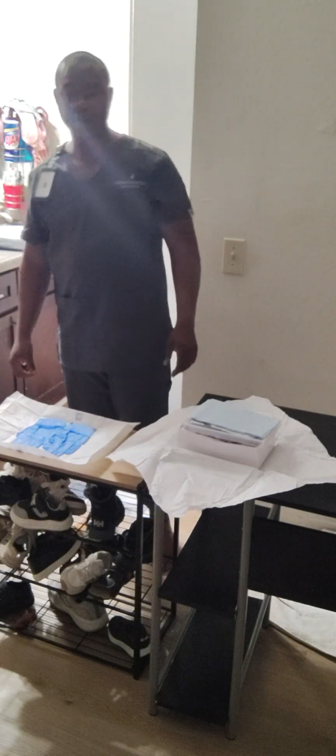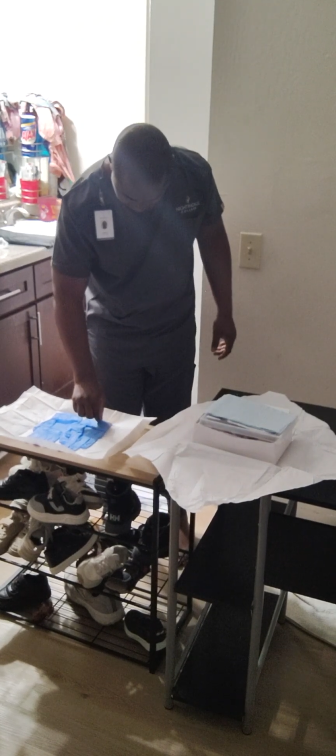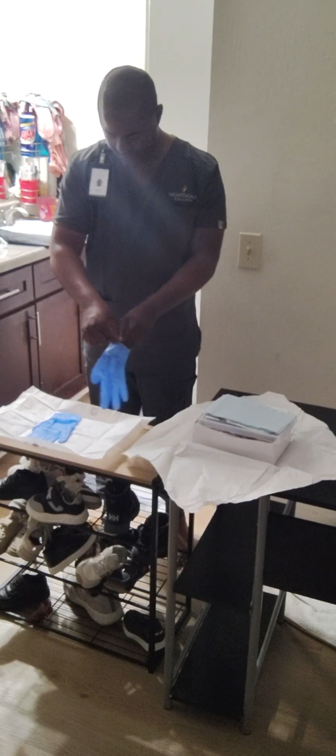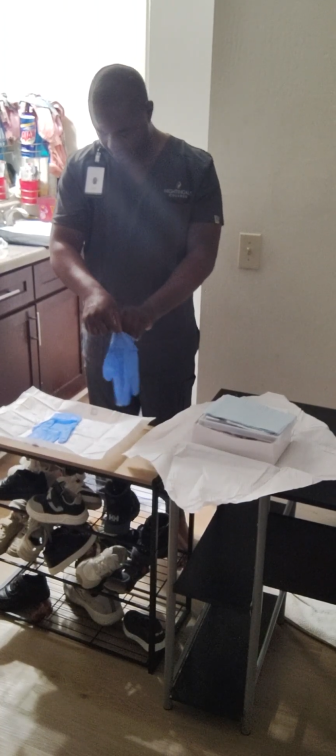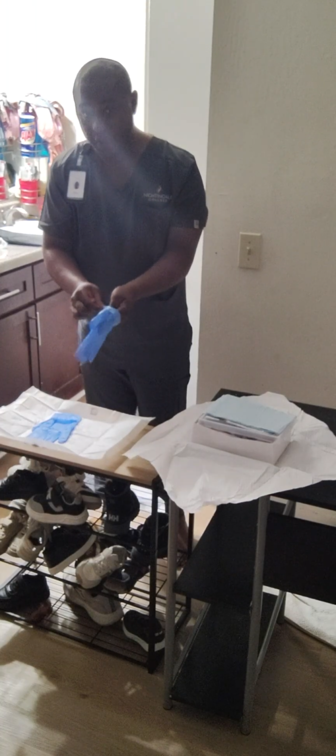I'm going to start with my non-dominant hand, which is my left hand. So I pinch that sterile glove, work my way in. Stay within that cuff.